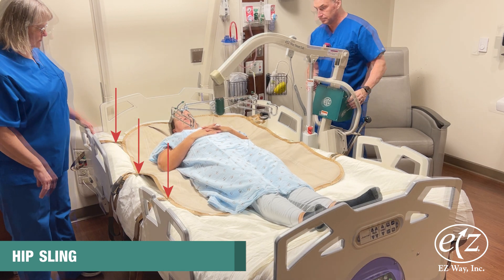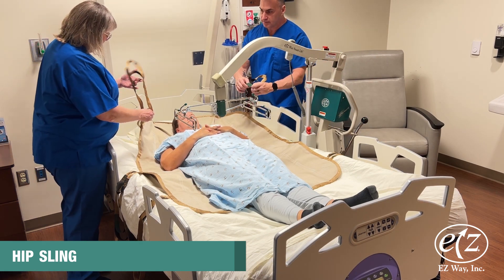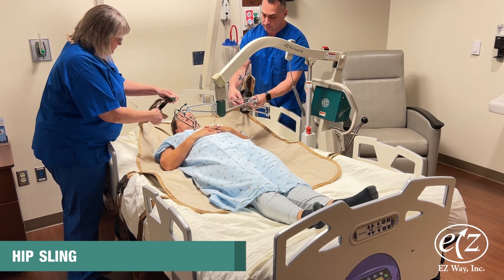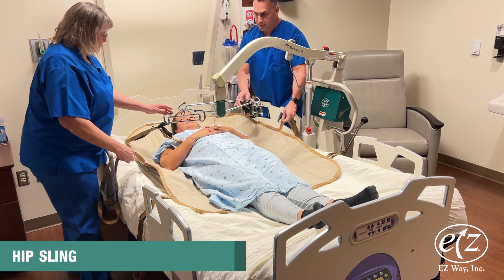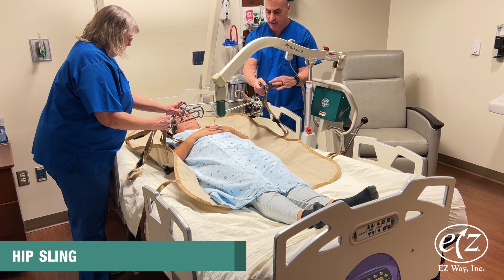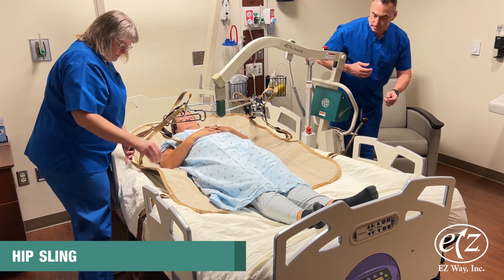Attach the corresponding loops of the hip sling to the sling hangers on the hanger bar. On a ceiling lift, the loops of the middle strap can be placed on the rear hook of the sling hanger. On a mobile lift, the loops of the middle strap can be placed on the sling hanger bar.